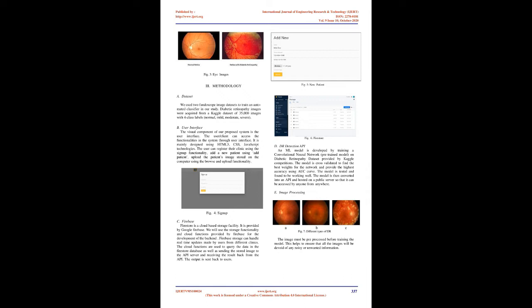Prototypical retinal disease stages. Computer-aided diagnosis of diabetic retinopathy has been explored in the past. This was done to reduce the burden on ophthalmologists and mitigate diagnostic inconsistencies between manual readers. Automated methods to detect microaneurysms and reliably grade fundoscopic images of diabetic retinopathy patients have been active areas of research. The first artificial neural networks demonstrated the ability to classify patches of normal retina without blood vessels, normal retinas with blood vessels, and pathologic retinas with exudates.